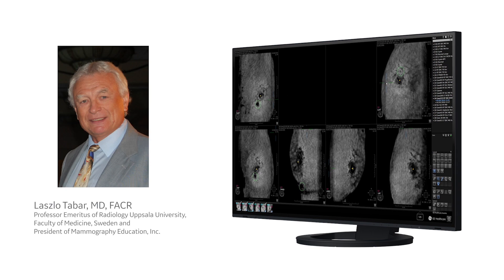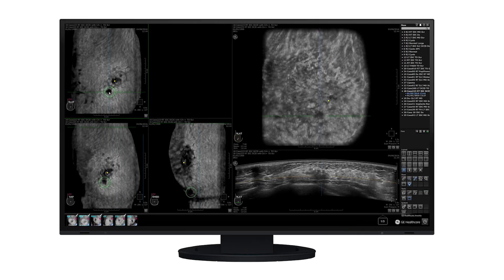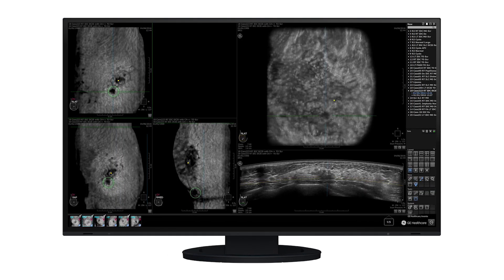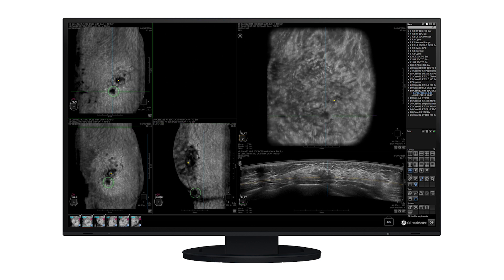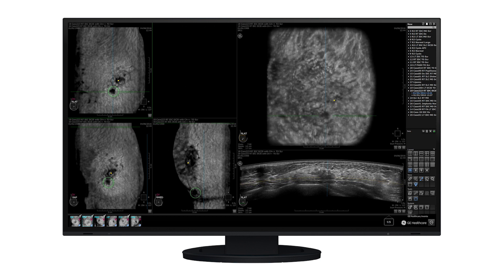The integration of QView CAD and A-Bus as a standard offering for radiologists will revolutionize our way of screening asymptomatic women with dense breasts. Reading the large number of A-Bus images can be both time consuming and often distracting.